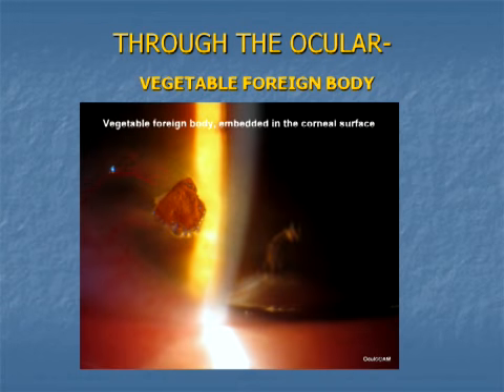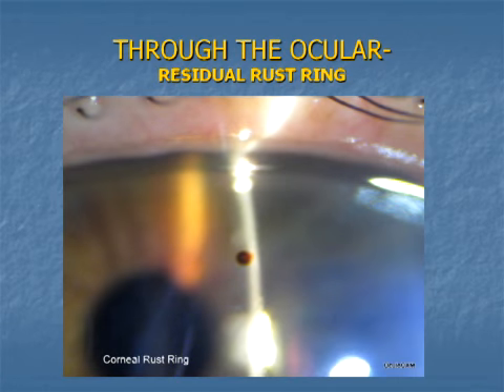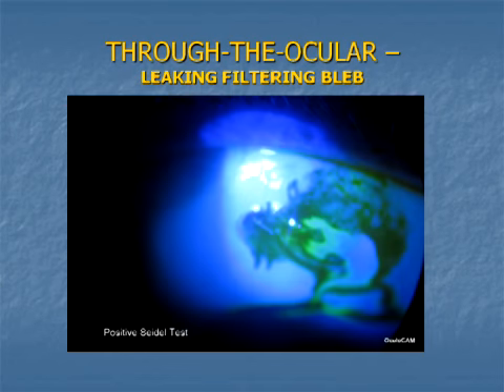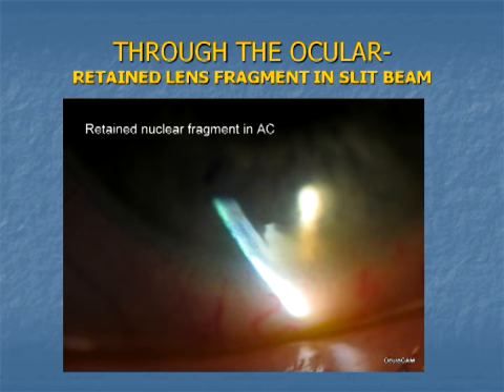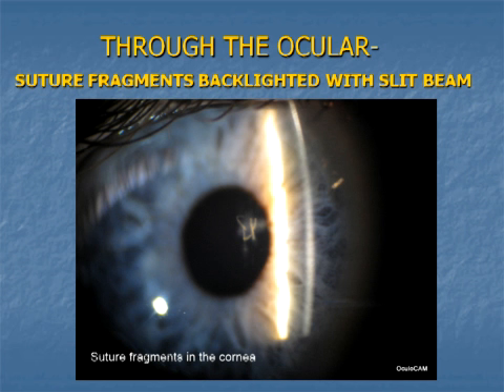This embedded vegetable foreign body stimulated vascular ingrowth. Here is a small residual rust ring from an iron foreign body. This leaking bleb shows best with stain in a Seidel test of the bleb's surface. Pits on the lens show up in the slit beam — pay close attention to focus with the joystick to get this level of resolution. The small fragment of retained cortex lights up in the slit beam at the limbus. Rose Bengal stains the cornea and the debris. The slit beam illuminates the ruptured sutures against the dark pupil background.